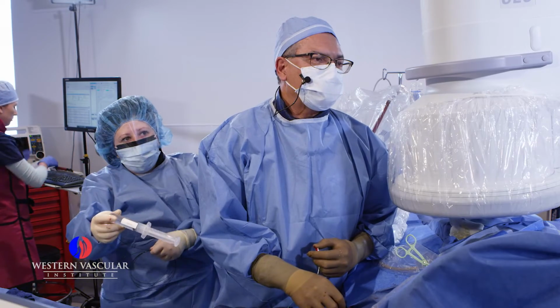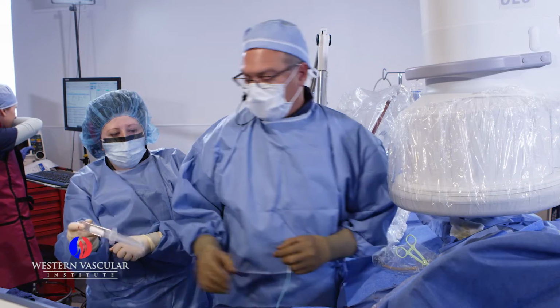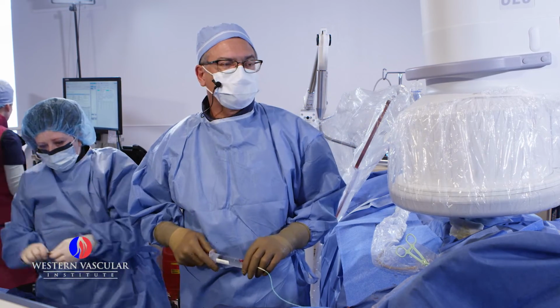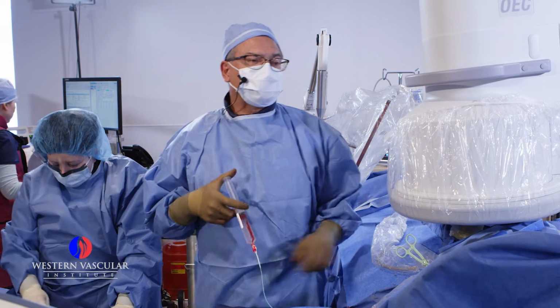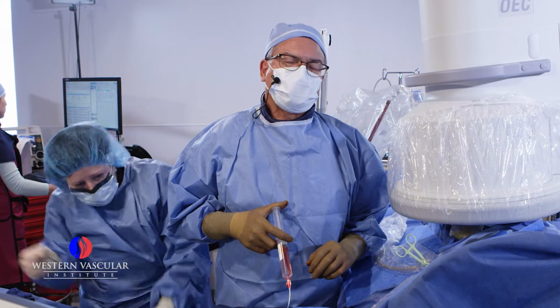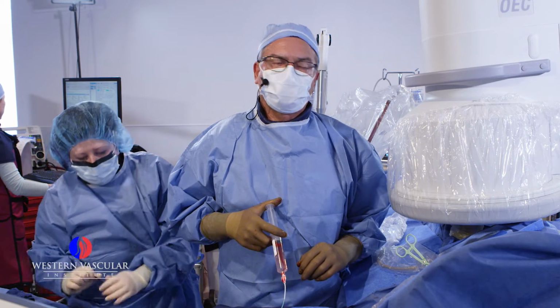So right at this level, we have the end of the catheter. We're gonna hook this up with a syringe containing some dye, or some contrast material. We're going to inject that, and that will give us a mapping, or the configuration, of the aorta. In that way, we can identify where the blockages are.